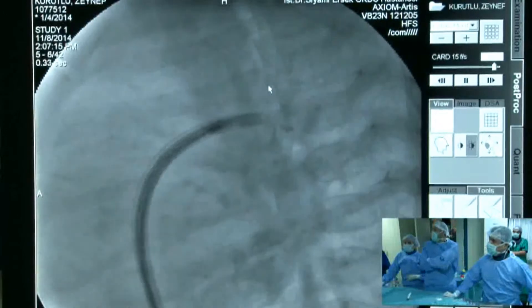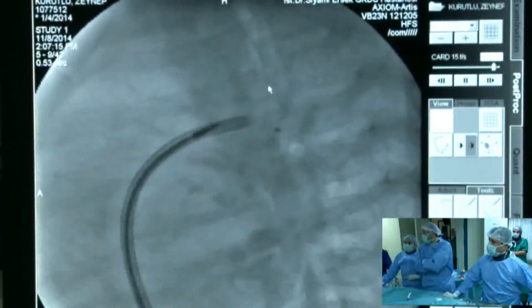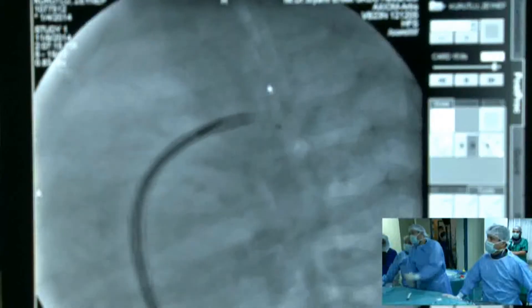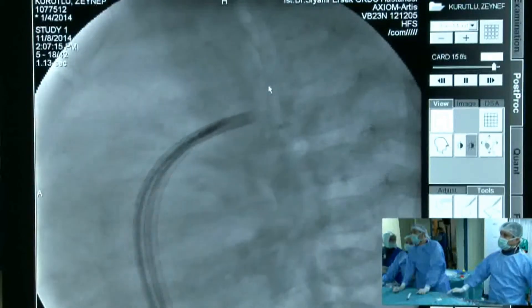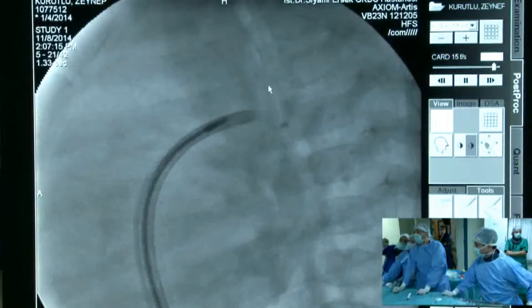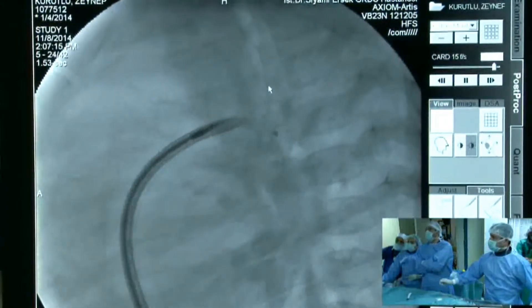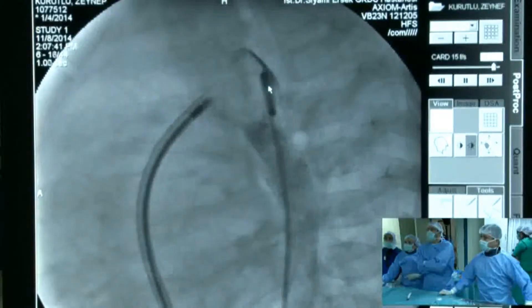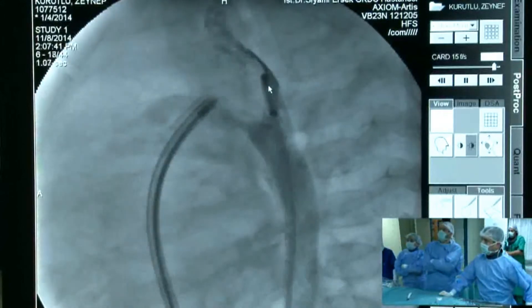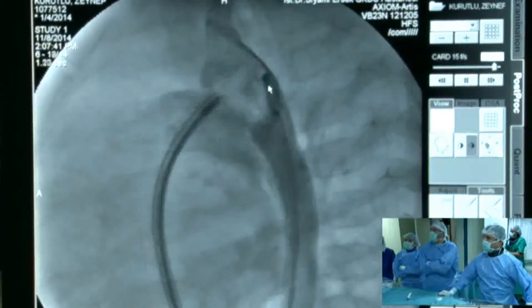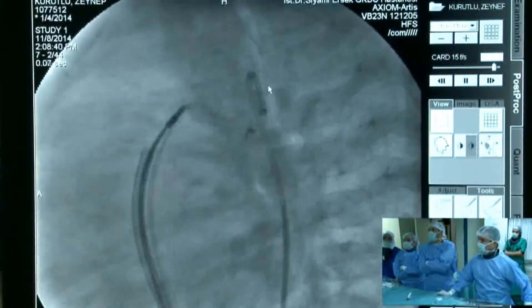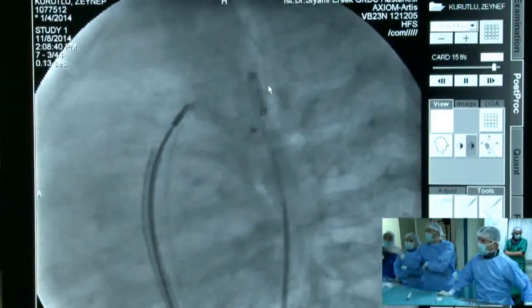This is the 6-4 cocoon device, similar to the Amplatzer Duct Occluder 1. First we deployed and opened the left disc, then opened the waist of the device into the ampulla. We observed some protrusion. We then retracted the device back into the long sheath, repositioned it slightly, and pulled it toward the pulmonary artery.